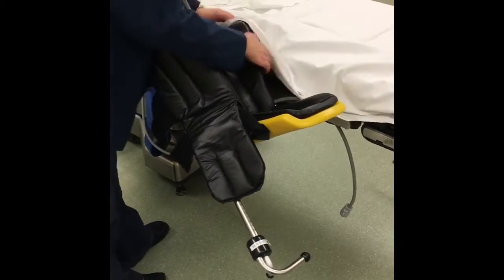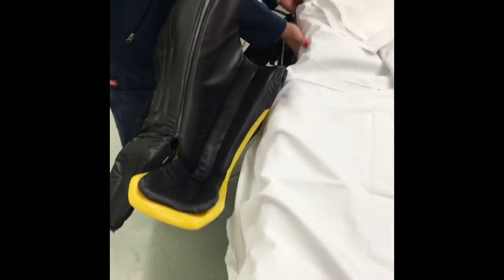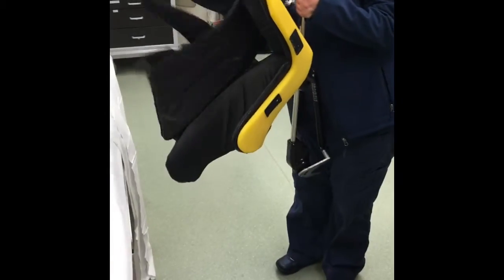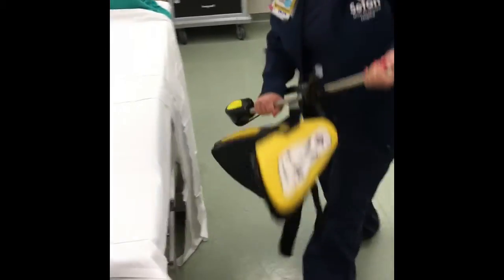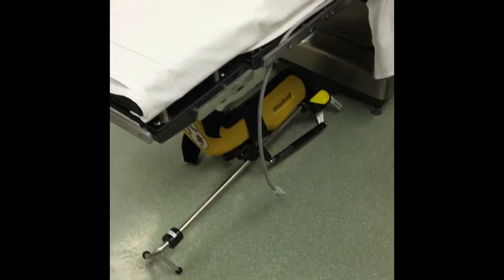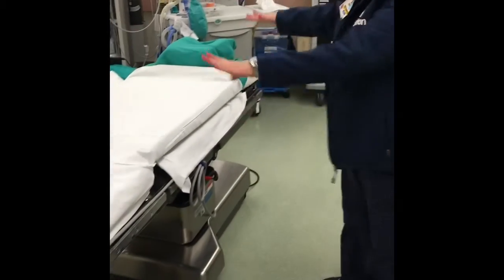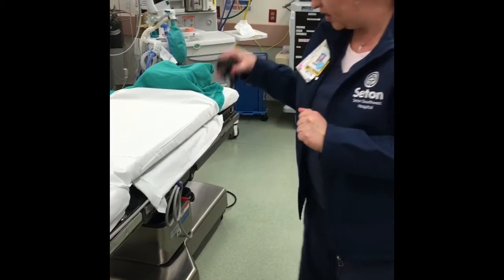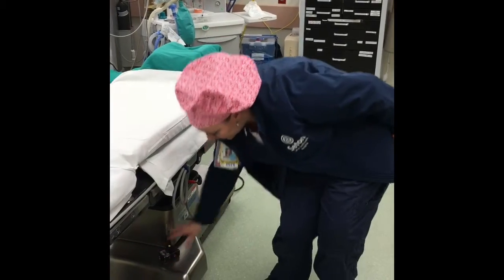And then we're gonna put our bed back together and just make sure it's all neat like we talked about. We want them to have that smooth surface. And the other stirrup, we like to place underneath the bed so that it's ready for you. So it'll go right there, because you're gonna need to bring your patient in and put them on the bed, so you'll want it underneath and not attached. And you can't put the clamp on yet either, because if not, the bed won't come in.